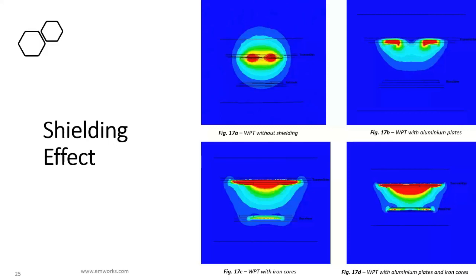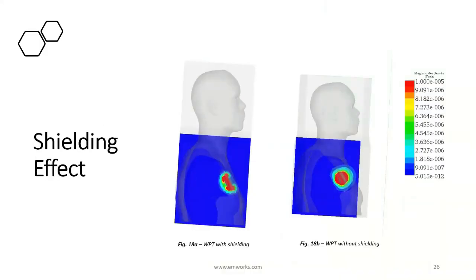The field became stronger by adding the iron cores. Having both aluminum plates and iron cores makes the field stronger and well conducted to the receiver coils. A smaller amount of the magnetic field is linked to the air now. This helps to reduce the power loss, protect a human body and electronic devices from electromagnetic interferences, and increase the coupling between both sides of the wireless charger. It's clear now what the impact of the shielding on the magnetic fields is. The field is well concentrated in a small region around the wireless charger in the presence of the shielding, while it propagates in a larger area when the shielding is removed.